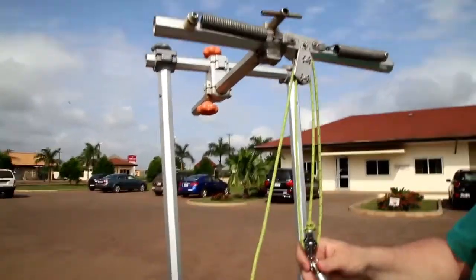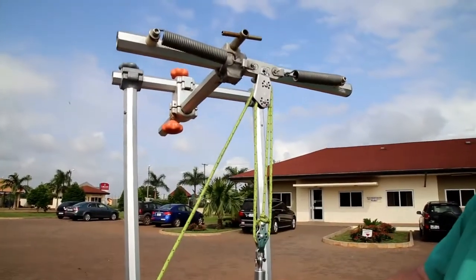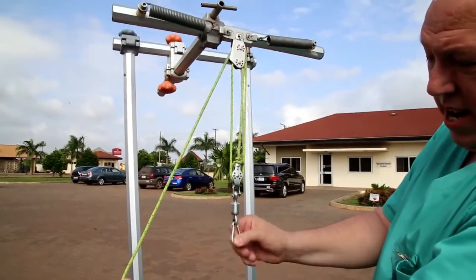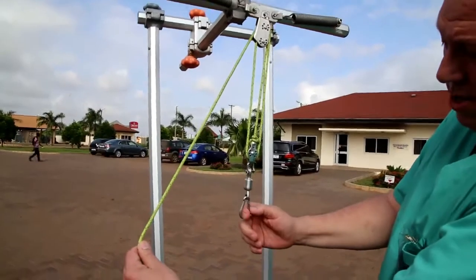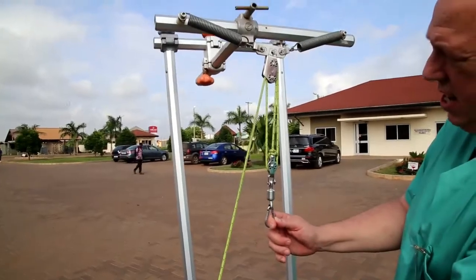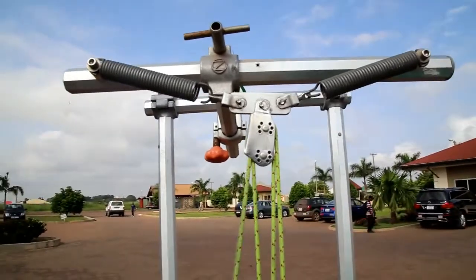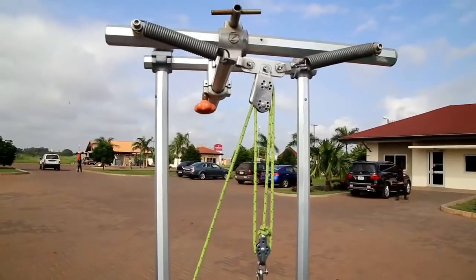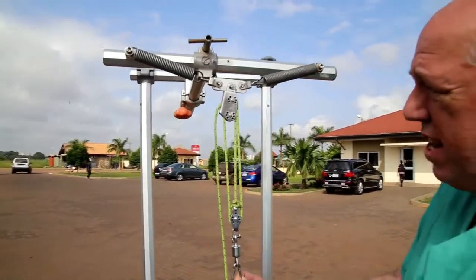We hook the traction unit itself to a halo ring, which allows the patient to rotate and move their head in any direction. Once we have this on a patient's halo, we can pull the string here to initiate load and lock it in place. I pull down to load it, lock it in place, and get the load on the traction system.